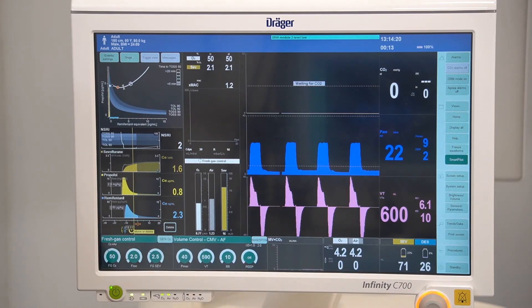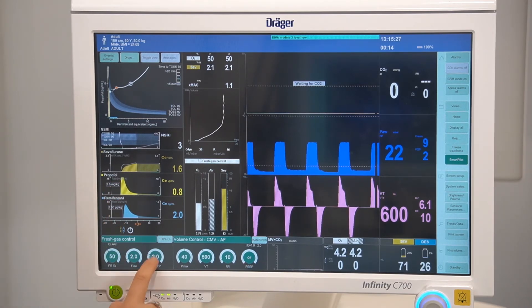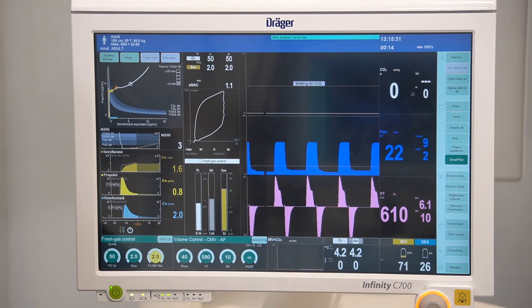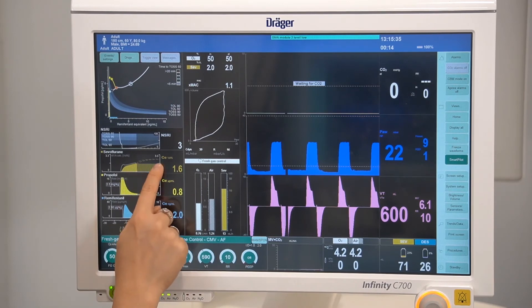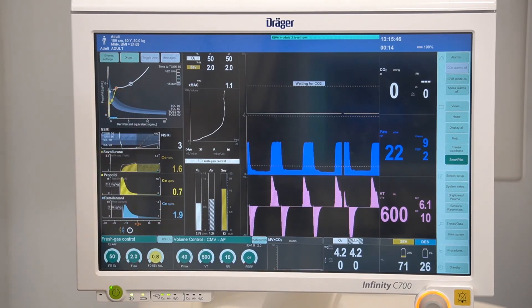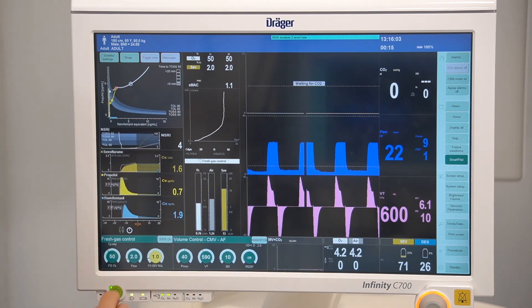Or delete this information. Making an adjustment to your volatile or to your drugs will show a predictive 'what if' feature on the graphs, displayed as a dotted line, as well as a yellow line seen in the isobal chart. If this is the desired pathway, confirm with the rotary knob.